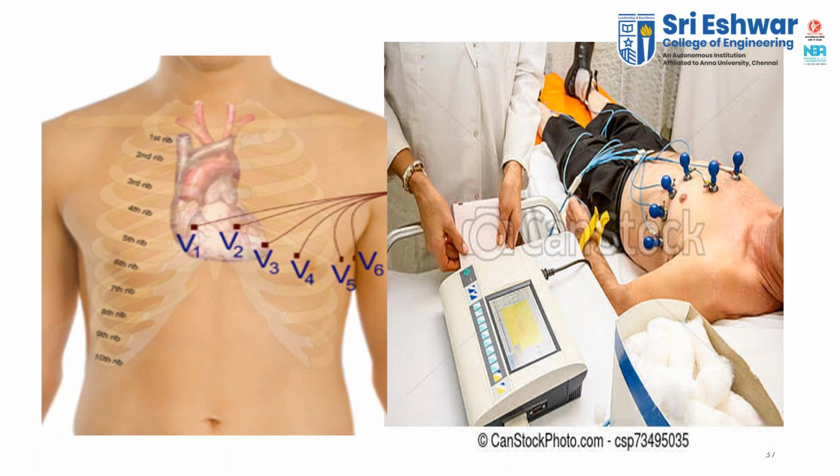Okay, right. So this is the first rib, second rib, third rib. Likewise, we are going to count the ribs, and the electrodes are placed in such a way here: V1, V2, V3, like that. So that the heart function and the biosignal will be extracted and given as input to this machine to get the output, the waveforms, on paper. This is suction electrodes. In the previous diagram, you could see surface electrodes. Here we have suction electrodes.